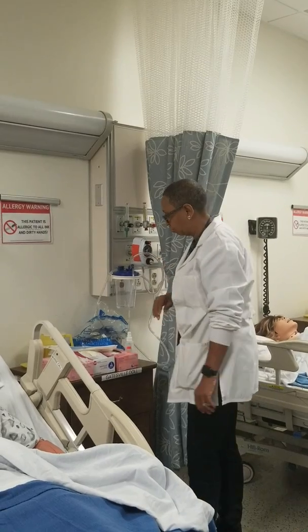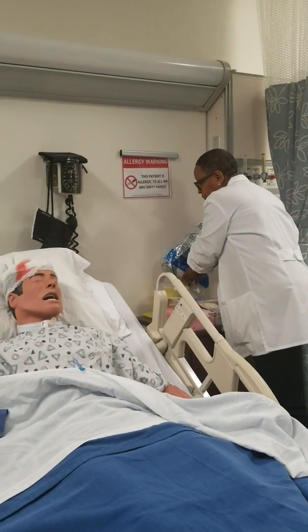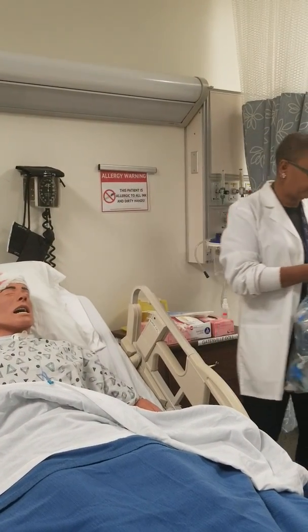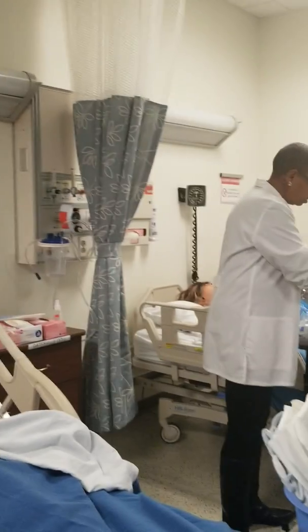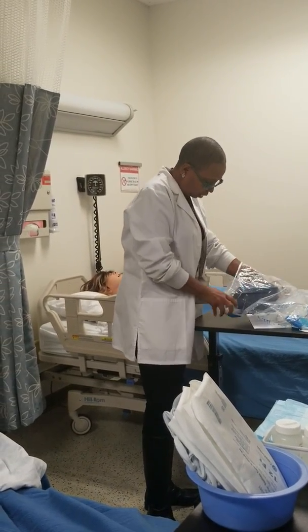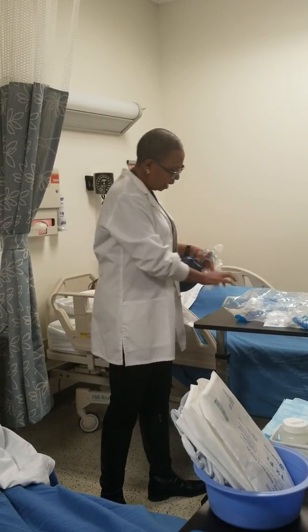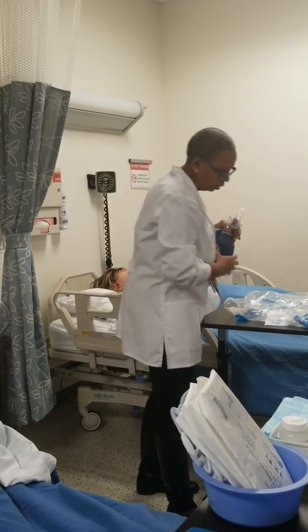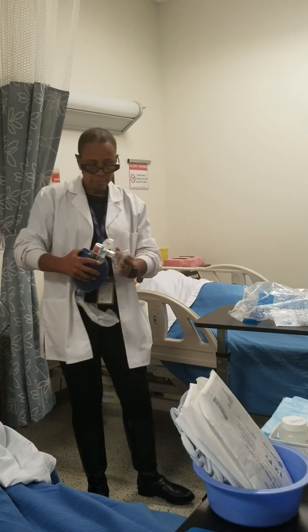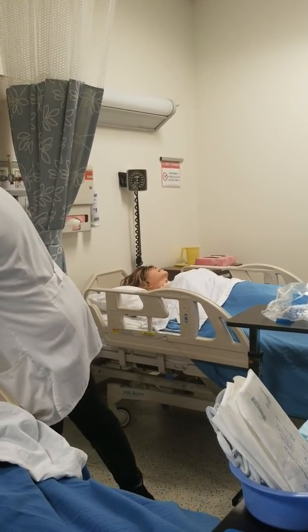What else do I need to do if I have to hyperoxygenate this person? I'm just setting up, seeing how he's breathing. If this person has to be hyperoxygenated and he does not have an oxygen collar on or something like that, I might have to use my bag mask. Usually you all find it like this, right? And usually you go in like this, right?